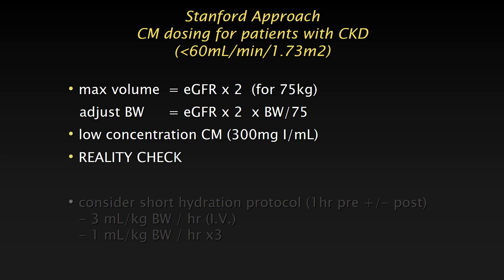If the formula suggests that you should use 20 cc's for an AAA patient just for surveillance, then you can say, well, this should be perfectly fine because you can scan fast, scan in 5 seconds, you can get a flow rate of 3 or 4, it will be perfectly enough. So you have to check this by yourself and make an executive decision, which has to lie on the physician side. You have to decide if you're going to do that.